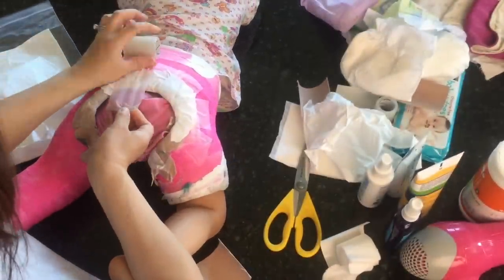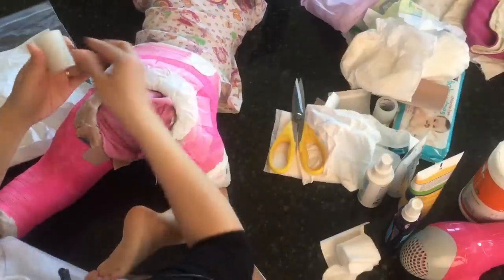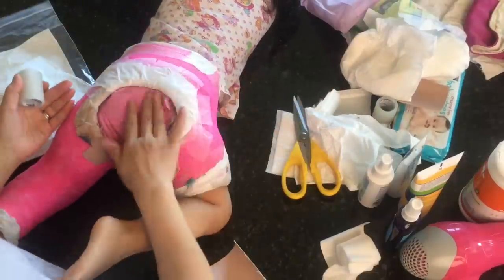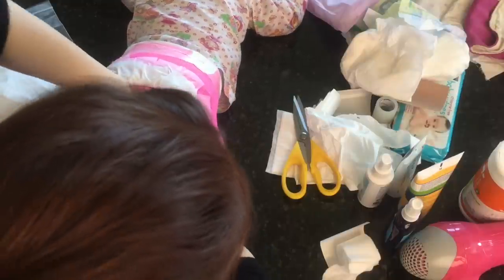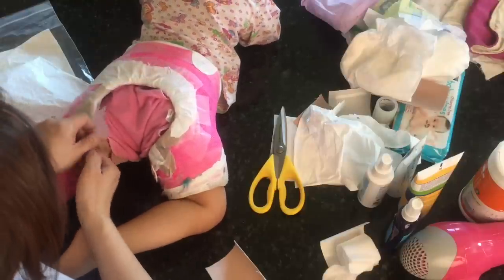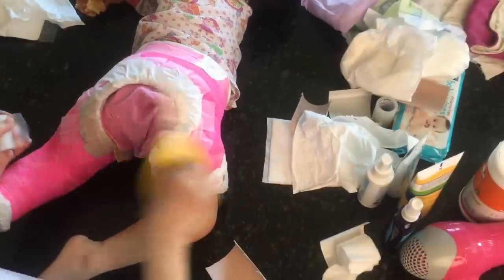You don't have to worry about being perfectly smooth inside because the diaper goes in there and they don't really feel it. The tape is also waterproof and won't irritate their skin. The hospital tape was expensive so they were careful not to give me too much, so I was very careful with how much I used — saving it for each time I needed to change the cast.